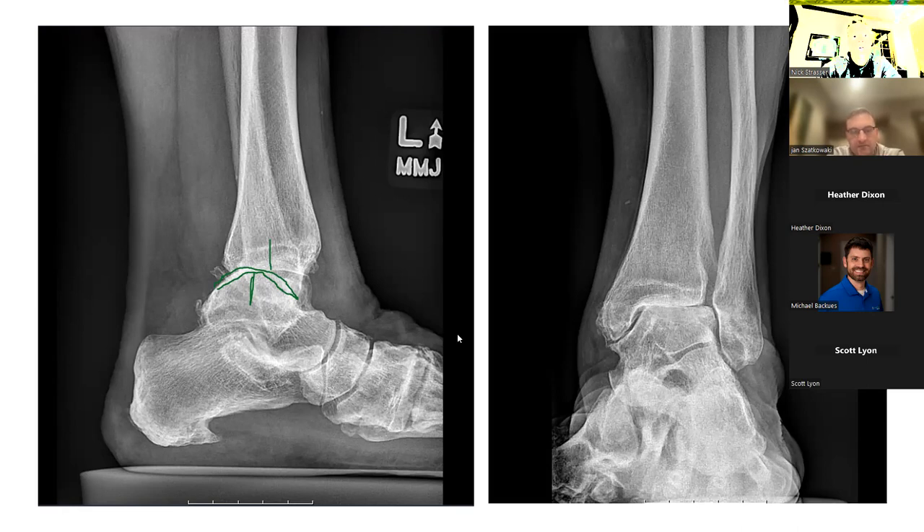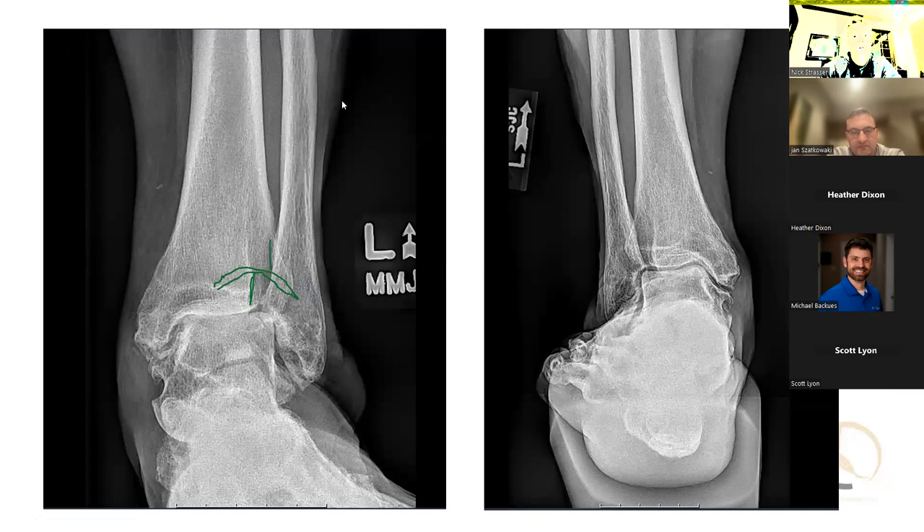If I go to the other views, you can see there's some valgus alignment of the heel. Do you get a Salzman view on these? I don't always — I clinically look at it. In a younger patient I do get the full-length hip-to-ankle view for the entire mechanical axis. But in this patient, in her 70s, I probably wouldn't be that concerned about her flat foot.